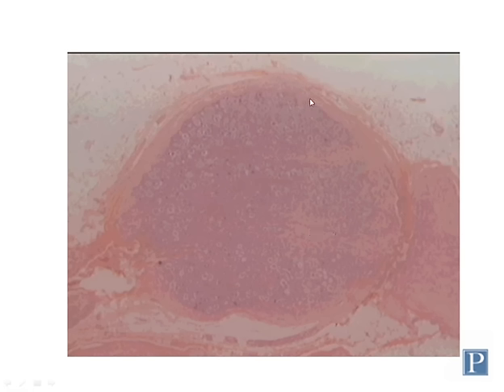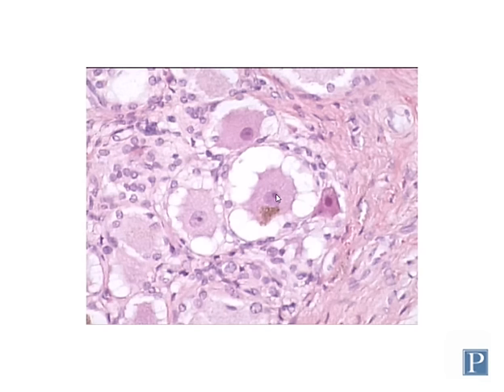So in order to see the cell bodies of these sensory neurons, you need to use a higher magnification view of the inside of the ganglion. That's what this particular slide is showing.